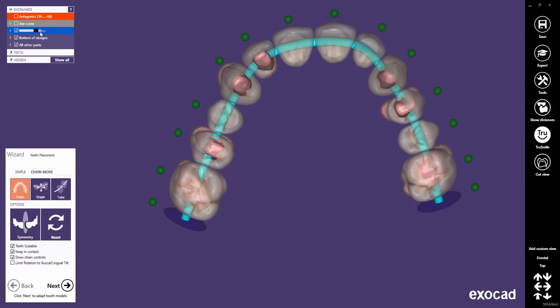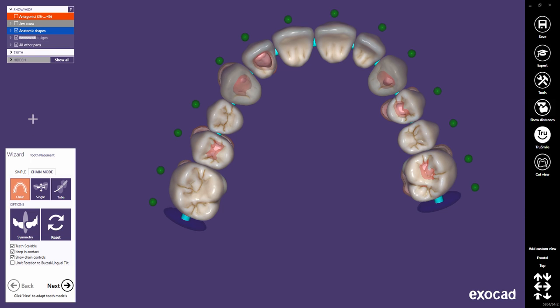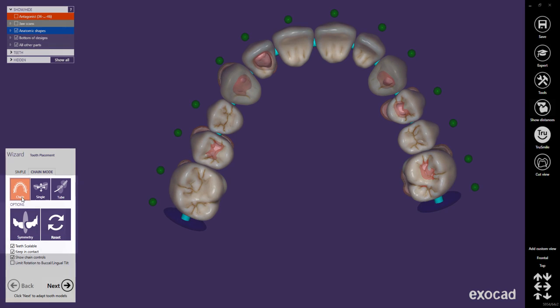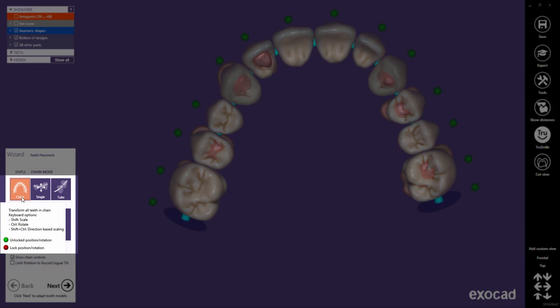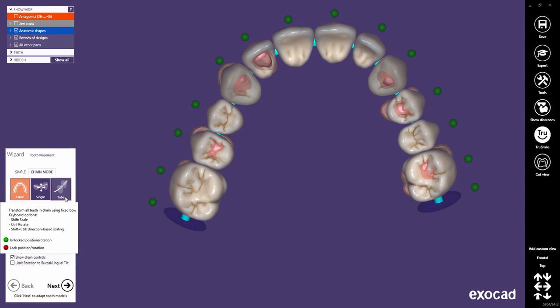There are three different Chain Modes. Chain transforms all teeth in a chain. Single allows single tooth transformations. Tube transforms all teeth with a fixed bow.